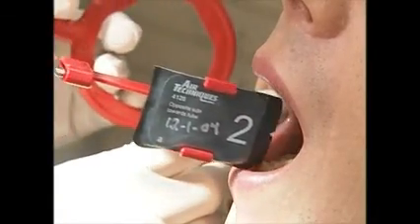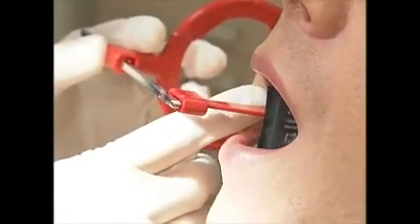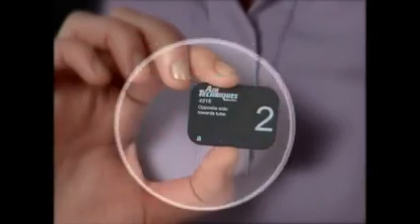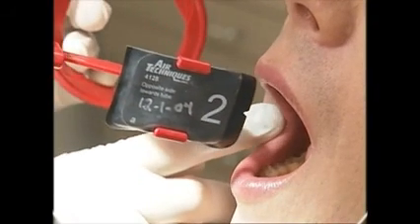Put the envelope with the plate inside into the patient's mouth, just as you would an x-ray film. The opaque side of the envelope faces the tooth, so as long as you can see the lettering on the plate through the window of the envelope, you're good to go. As an additional help, on the printed side of each plate is a letter A. This is like the reference dot on x-ray films. Orient the plate in the patient's mouth so the A is in its normal upright position, like you would see it when reading.